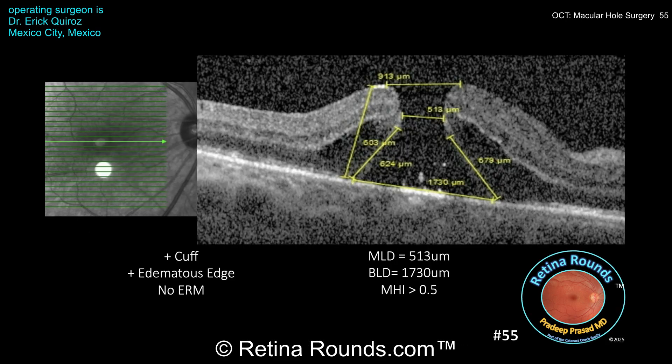Here's the patient's preoperative OCT, and you can see that Dr. Quiroz has made a number of measurements on the horizontal B-scan going through the macular hole. There are many factors that you can look at for the preoperative OCT — fundamentally what we care about are findings that can help guide our surgical decision-making, like what technique we're going to perform, and to give the patient information about successful macular hole closure and their visual prognosis.